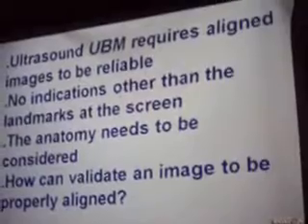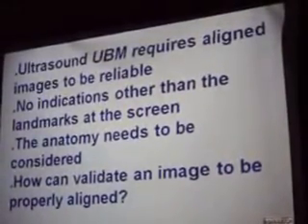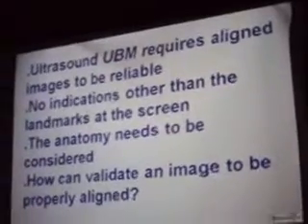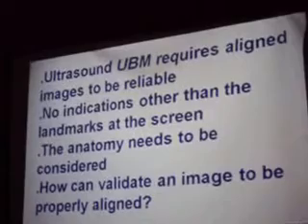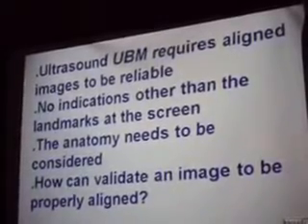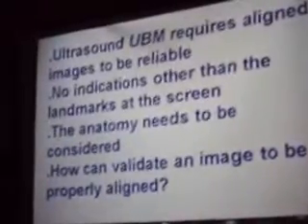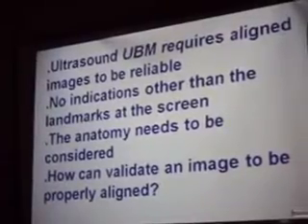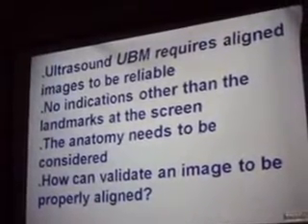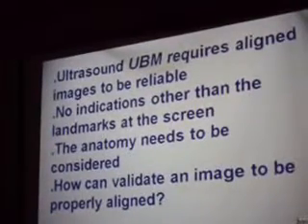Okay, but in order to evaluate properly a pre-op and a post-op ICL surgery, or any refractive surgery, we require alignment. Ultrasound is different than any other imaging device or imaging technique used in ophthalmology. We are used to getting the joystick with X, Y alignment, then there is an autofocus and click, the picture is done. There's no need for alignment. In the ultrasound, it's not the case. In the ultrasound, it's you and your probe and the eye.